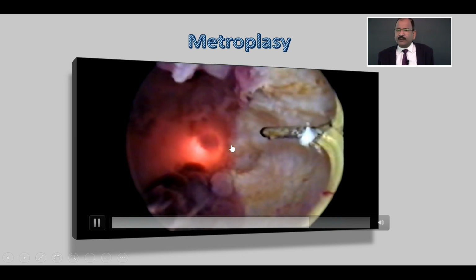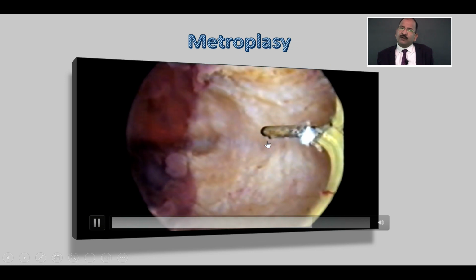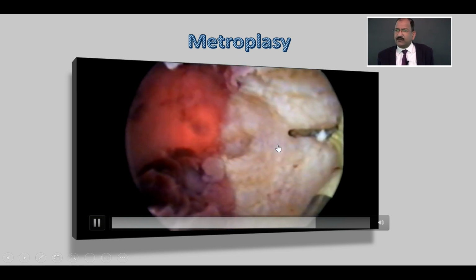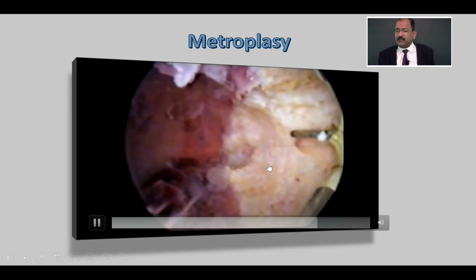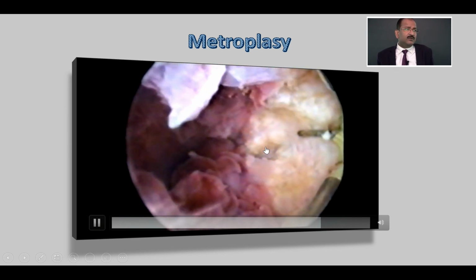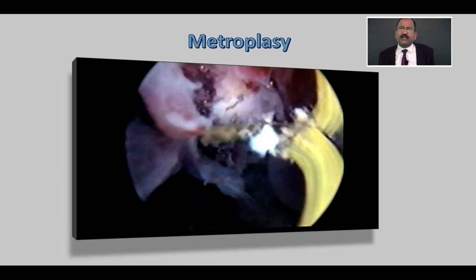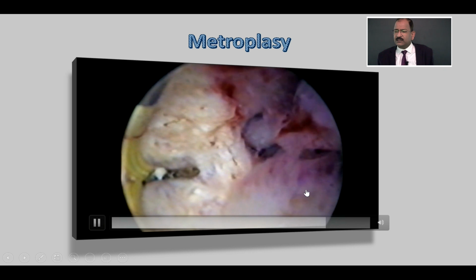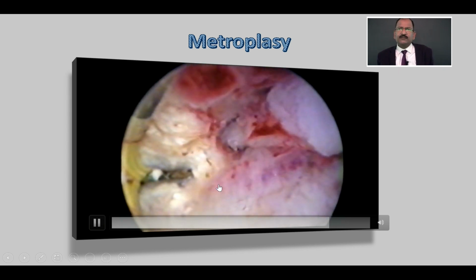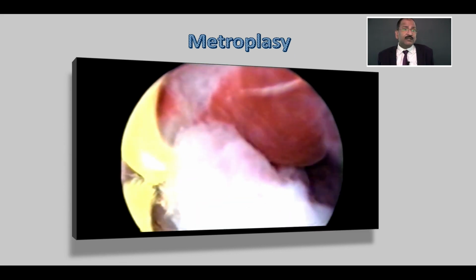So that's why operative hysteroscopy, if you are doing it under laparoscopy, it is always appreciated. Because you have added safety and you can find out if any complication happens and you can repair it also. If suppose accidentally we have perforated, take a bite and suture it by the laparoscope. That's all, there is no problem, nothing happens, patient will not suffer. And suppose it is perforated, then never put an IUCD, the IUCD will migrate.